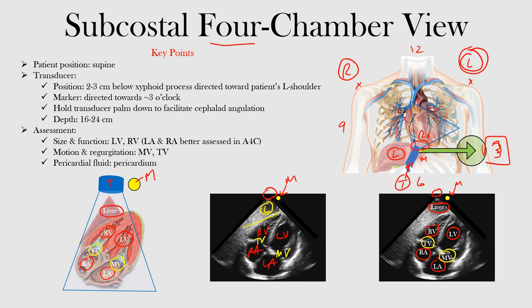In this view, we can assess the size and function of the left ventricle and right ventricle. The left atrium and right atrium tend to be better assessed in the apical four-chamber view, but you can see them here as well. We can look at motion and any regurgitation at the mitral or tricuspid valves — so mitral regurgitation or tricuspid regurgitation. You can also see the pericardium — is there any pericardial fluid surrounding the heart in the pericardial sac? We may see it as black.